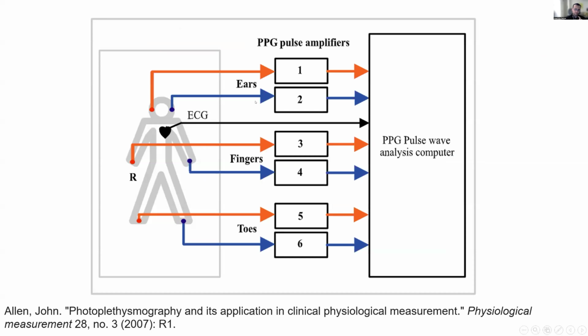One important thing to keep in mind when talking about PPG, at least for regular clinical measurement, is that it can be measured on different spots of the body. The finger is probably the preferred spot, but sometimes for various reasons, this may be measured on the ear or on the foot, and even on the chest in some companies.